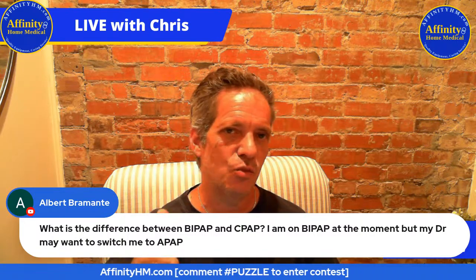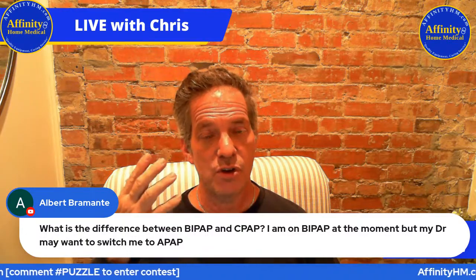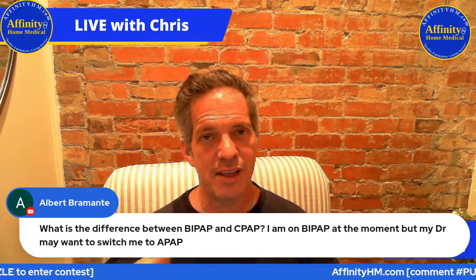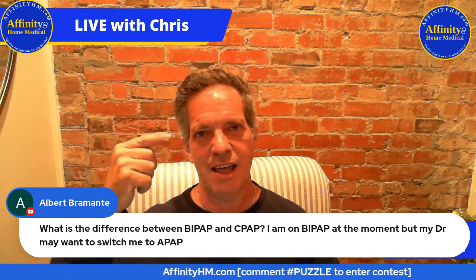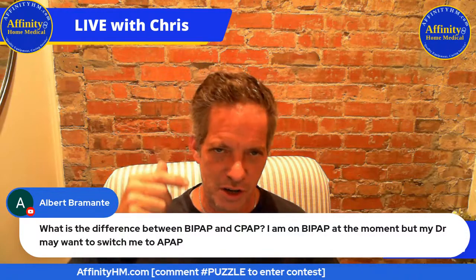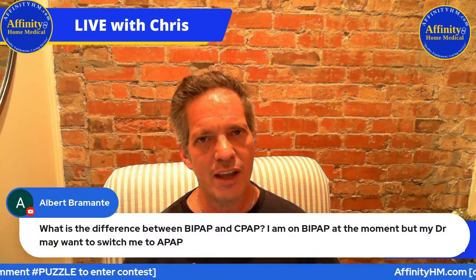BiPAP is different in this one simple way. The pressure is higher when you're breathing in and lower when you're breathing out. It has a sensor, so it can tell as soon as you end that inspiration, it switches the pressure and allows you to exhale way more easily. It's a lot more like regular breathing.